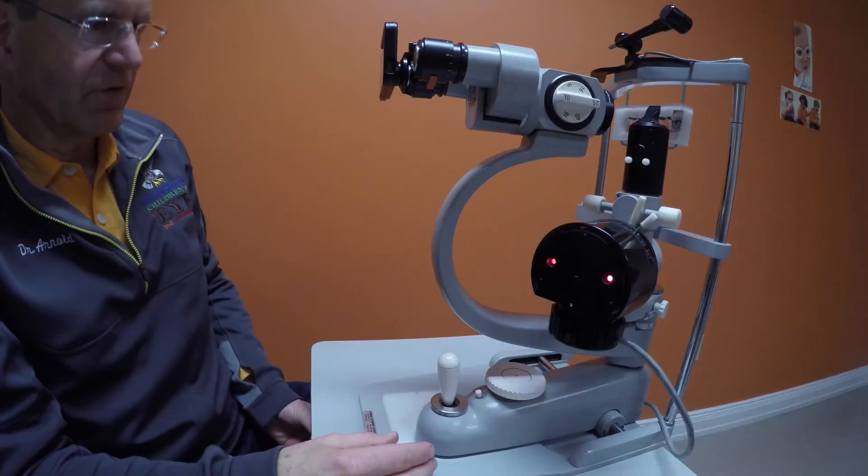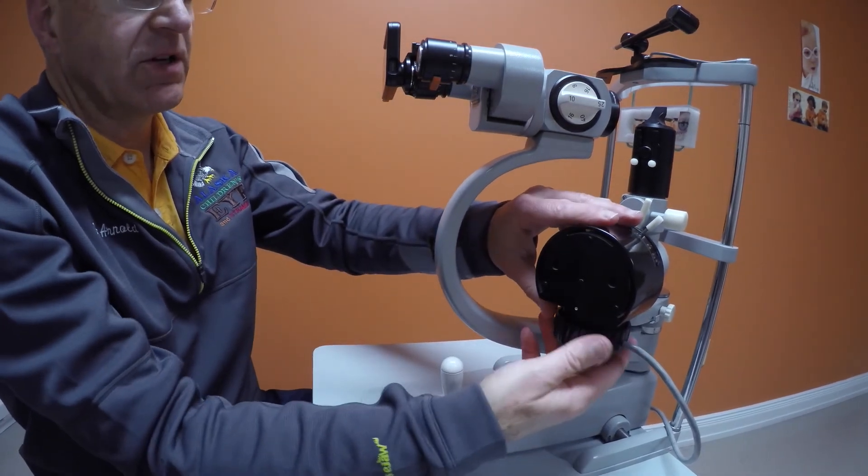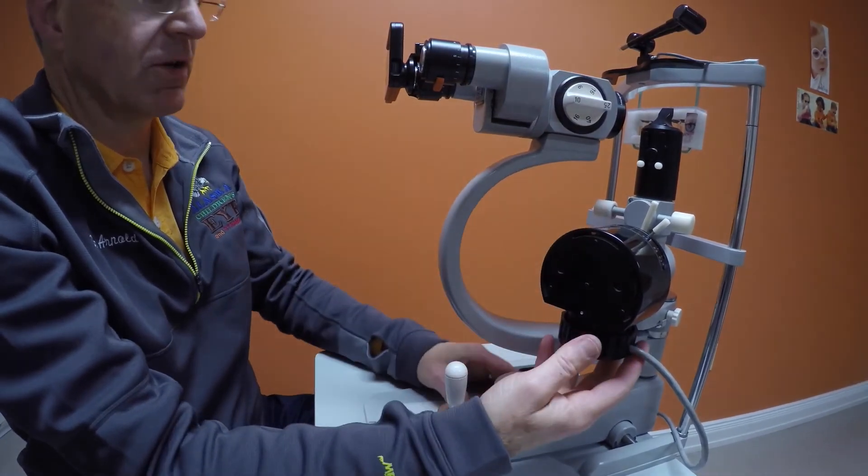Alright. From this point, we have the rheostat up, we have the beam width up. Turn it off. The bulb to the slit lamp can be changed in the middle of this housing on the slit lamp.